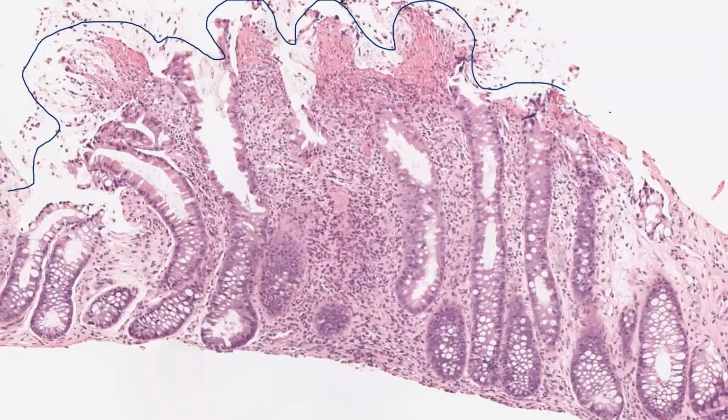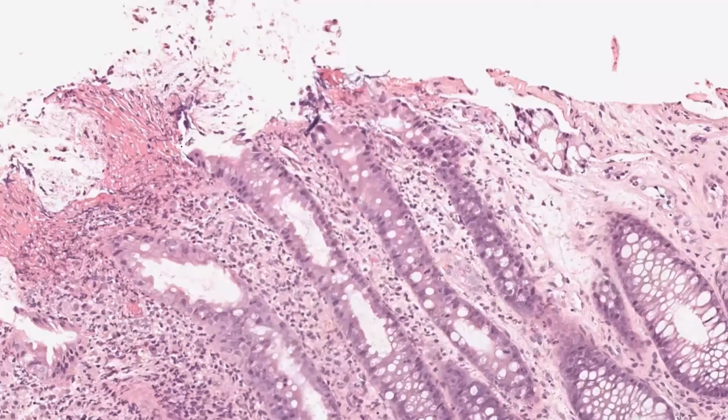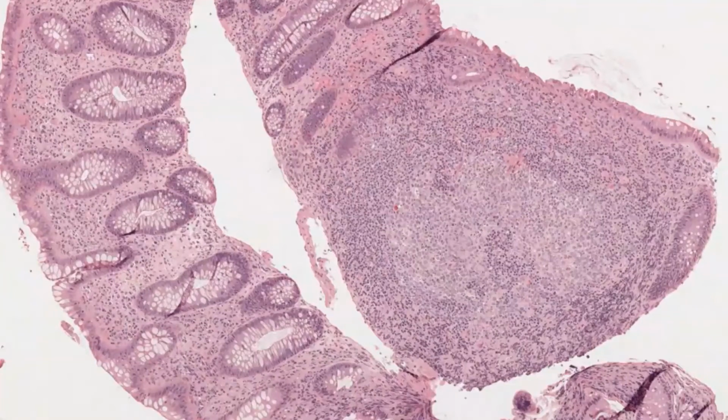And if you don't pay attention again to the surface, or you consider that this is only surface erosions, which is a common mistake that we can all fall into, then you will not see that this was a Clostridium, and then the patient is struggling for another 3 or 4 weeks. Still the patient will get the toxic megacolon, and then will get a total colectomy. And this is because you failed to recognize that this irregular surface with a pseudomembrane, and you didn't really pay a lot of attention. You will just, in the back of your mind, be thinking about other stuff. But here I just wanted to show you the example, and here is the close-up of that pseudomembrane, and it is like the volcano eruptions, like what the textbook would love to assess.